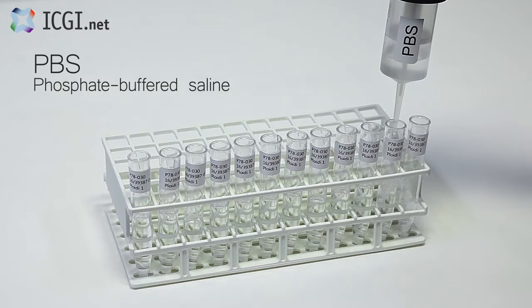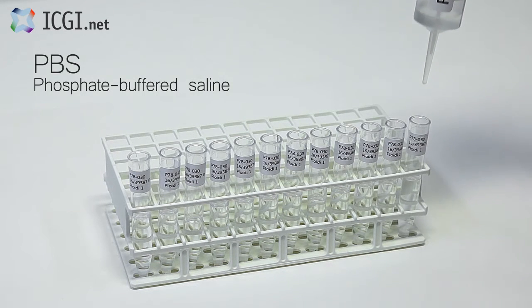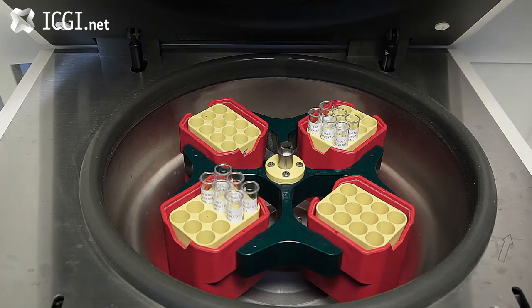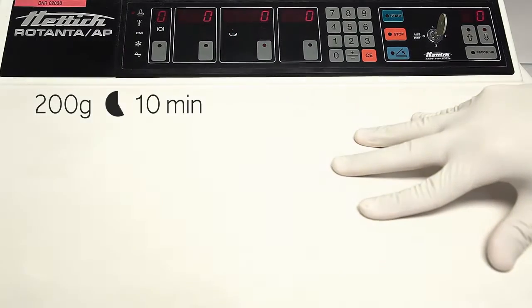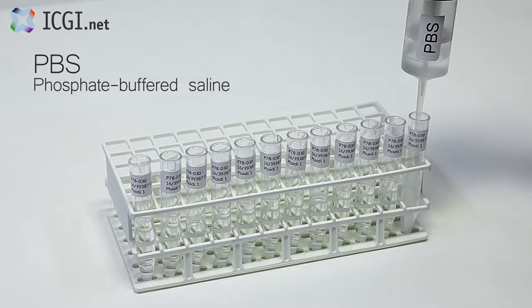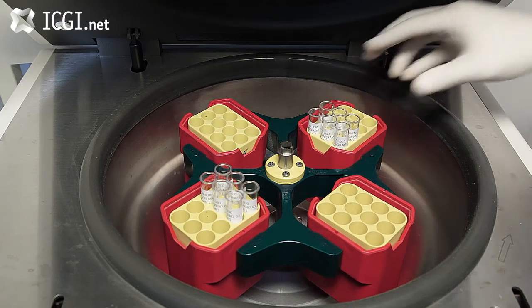After rehydration, the tissue is washed using phosphate-buffered saline (PBS), and the test tubes are spun in a centrifuge at 200 G for 10 minutes. The supernatant is then removed with a pipette, and new PBS is added before a second spinning.